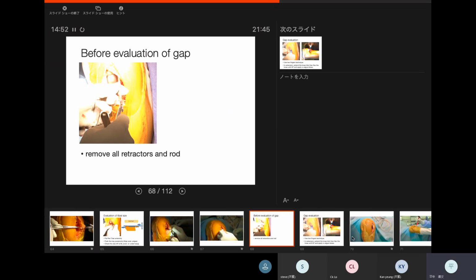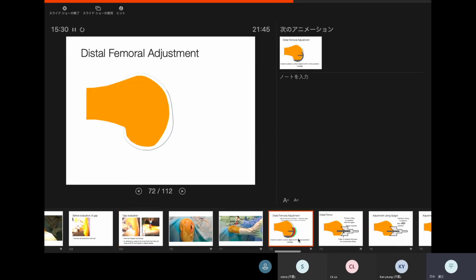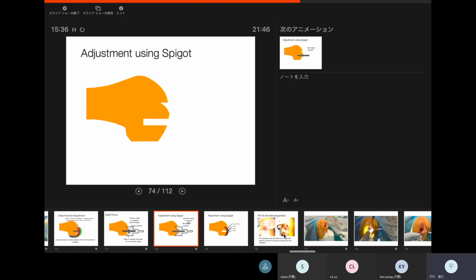Then before the gap evaluation, you should remove all retractors and compare the flexion gap and extension gap. According to the manual, this gap should be evaluated at 20 degrees flexion under the valgus stress. But I strongly recommend checking the gap not only at 20 degrees but also in full extension, because sometimes some knees are looser in extension. And then adjust the distal femoral cut using the mill and spigot.